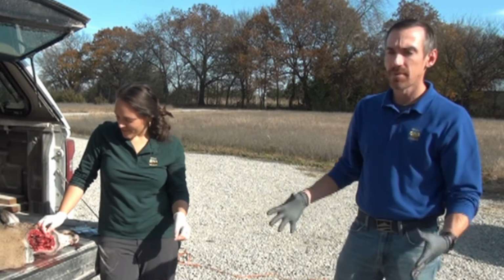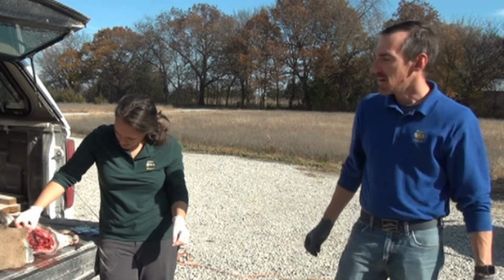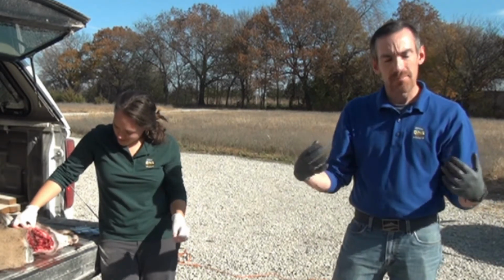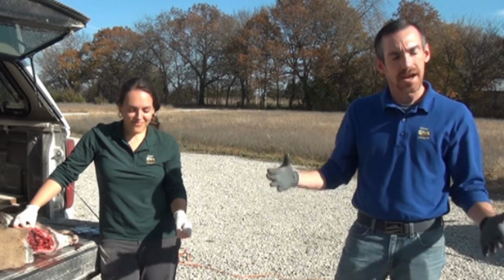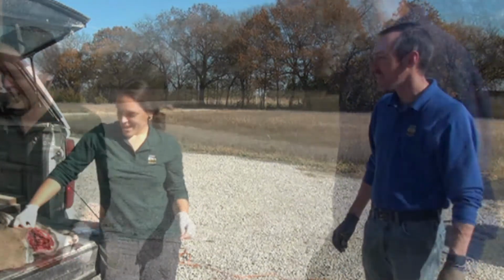And so when we're sampling for our surveillance program, we call those the A's and the B's, basically. The A's go to the lab, the B's hang back with us in case something happens, and we have that extra because we want to make sure we get those test results back from that animal.